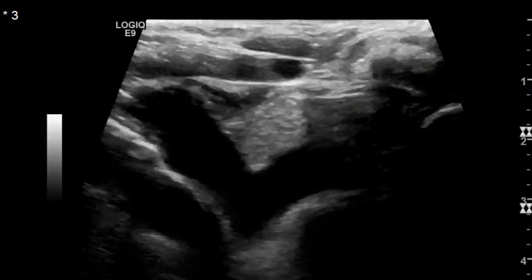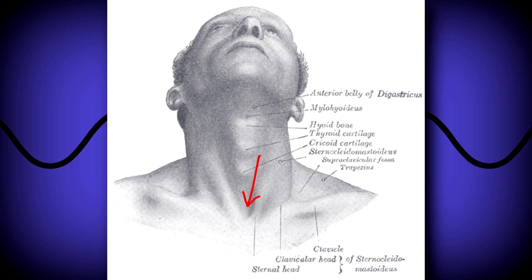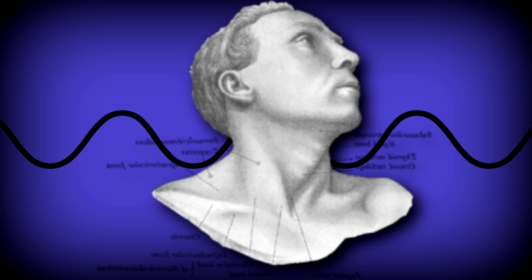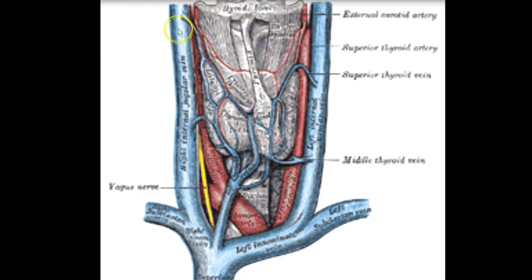Once you're done with the superior vena cava, repeat this step with the right and left brachiocephalic veins. This trio of vessels can be quite tricky for the beginner. Use the suprasternal notch and angle towards the heart. You'll use either a linear transducer or, in bigger patients, a small vector. Also use the patient's position — have them turn their heads to the right and to the left — and use paramedian approaches.